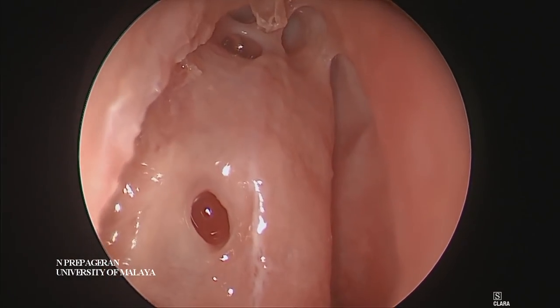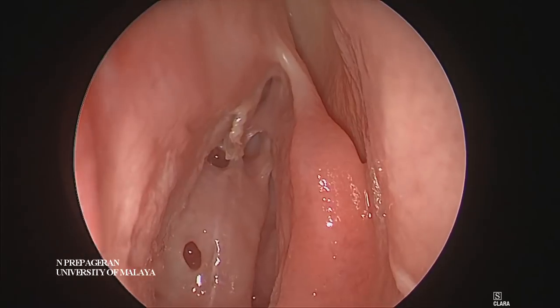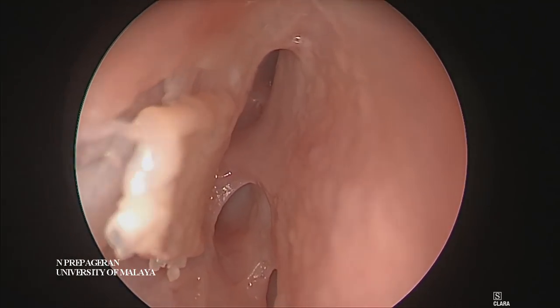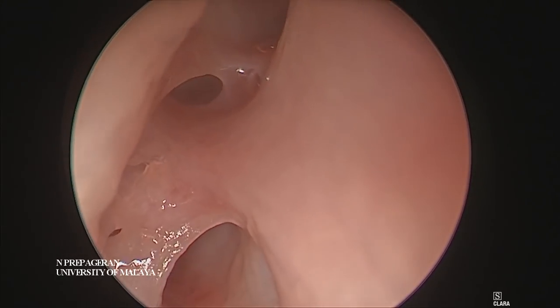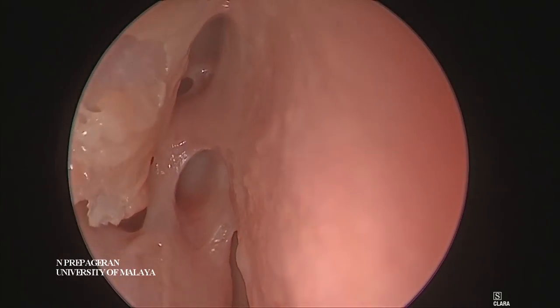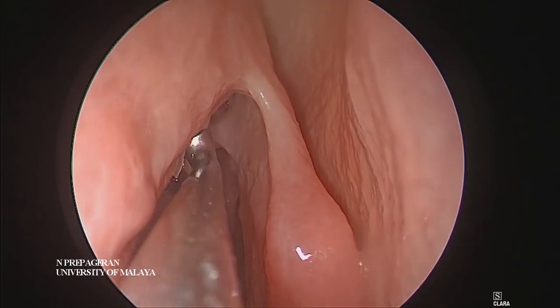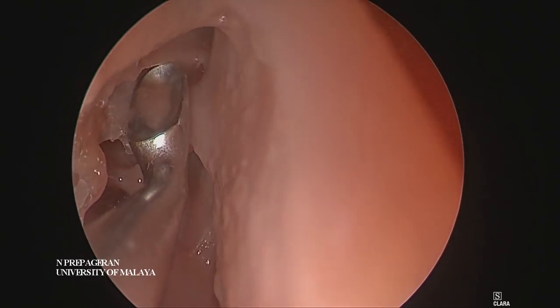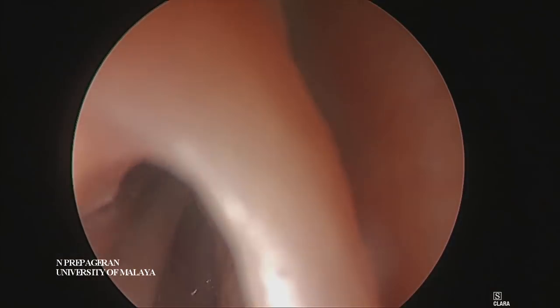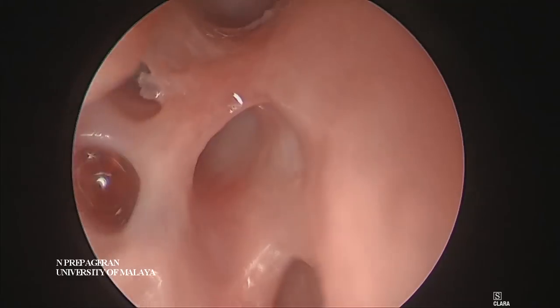I'm not changing scope — I'm just going to move my scope from being anchored to the top of the nose to the floor. And now you look up and you can actually already see the frontal recess coming into view. There's a frontal recess area coming into view. So all we need to do is enlarge this opening and we should be in the frontal recess. So if we open up the uncinate process here, flick it forward — as you can see, we are now in the frontal recess. Try to minimize the amount of damage that you have on the mucosa. This most probably is the frontal drainage going into the frontal sinus.